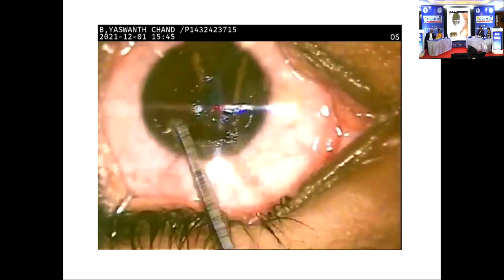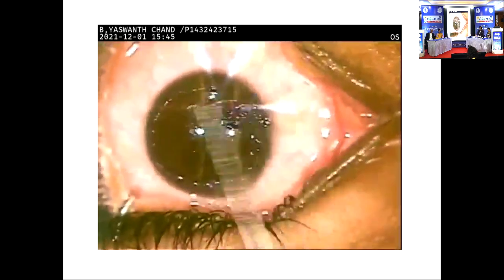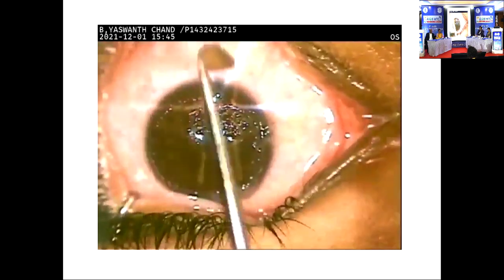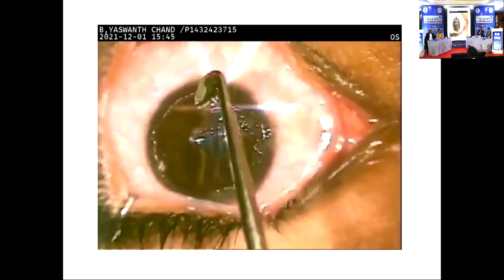Patient cooperation is important, but not a big issue, because most of the treatment in trans-PRK is over within a minute before you can even realize. And here it takes a little longer in the case of classically debriding the epithelium manually.